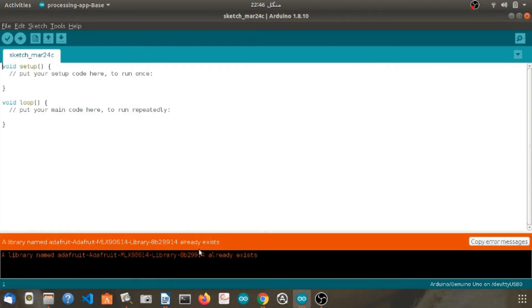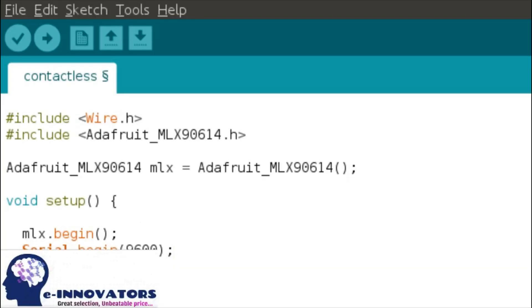As I have already installed this particular library before on my Arduino IDE, this statement appears on the screen. Now let's move on to the programming part of this sensor.